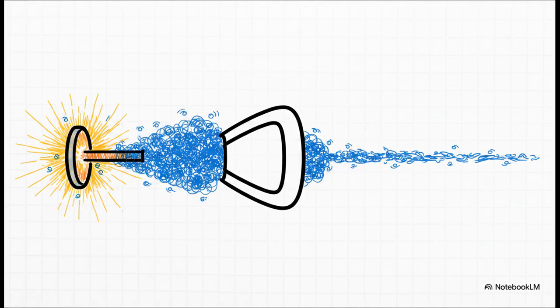Now, the physics of how those electrons actually get free is just fascinating. It all happens through a process called thermionic emission. Basically, we heat a tungsten filament to an insane temperature. We're talking over 2,000 degrees Celsius, until it literally starts boiling electrons right off its surface. This creates a charged cloud, kind of like water boiling into steam. Then a focusing cup wrangles that cloud and aims it precisely where it needs to go.